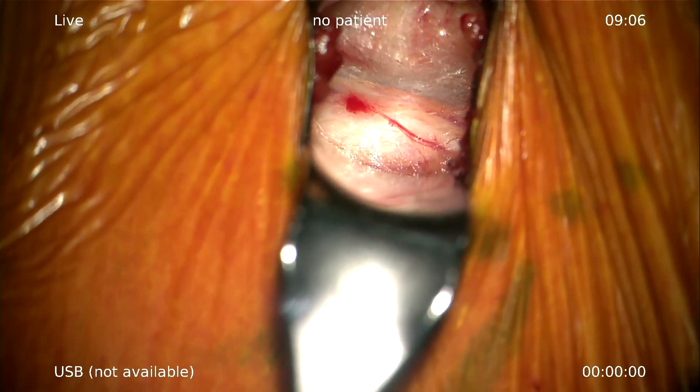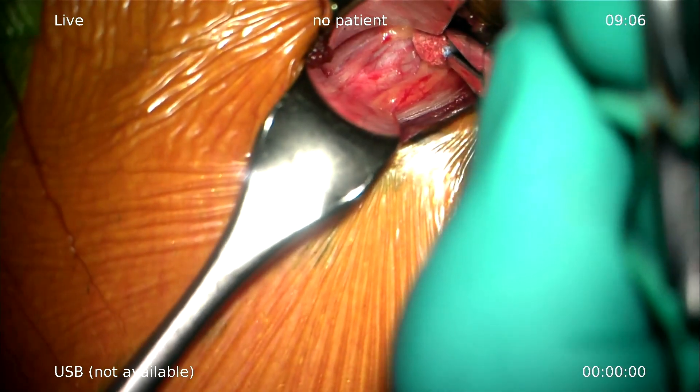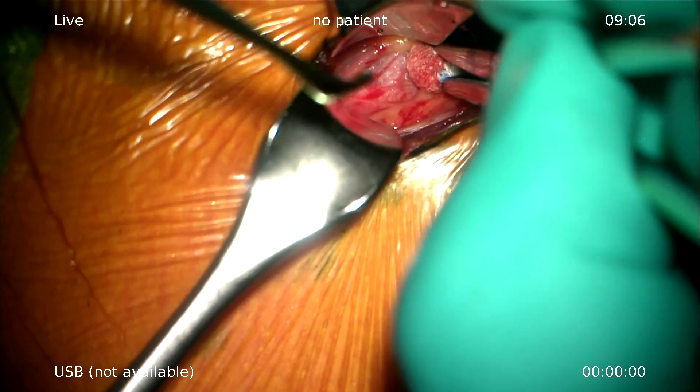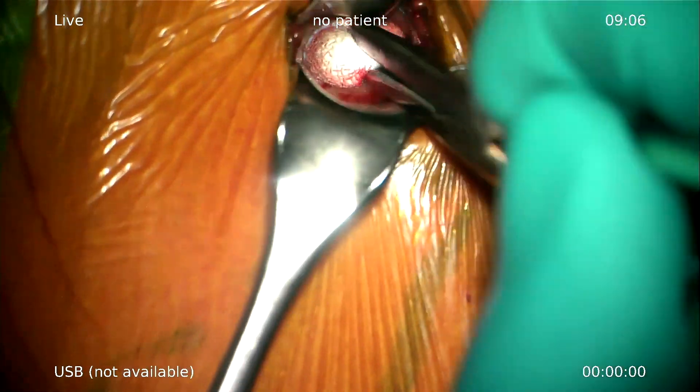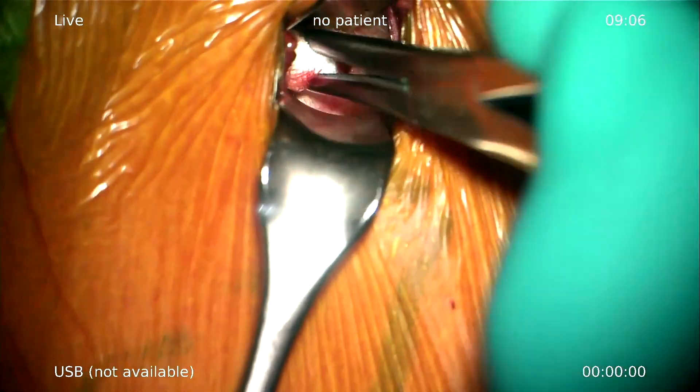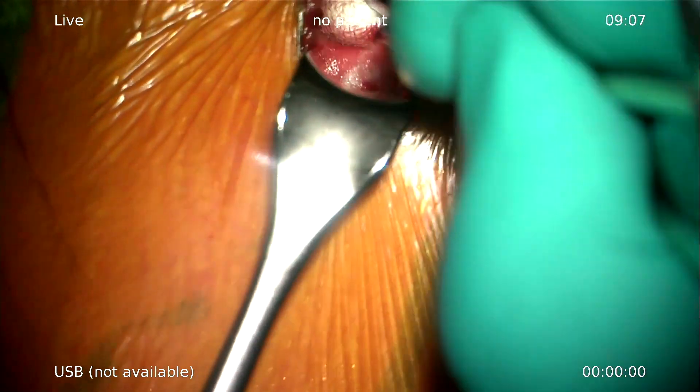Pulsating — this is the carotid artery. Keep this artery to the lateral, and then you push the esophagus and the trachea to the contralateral side.